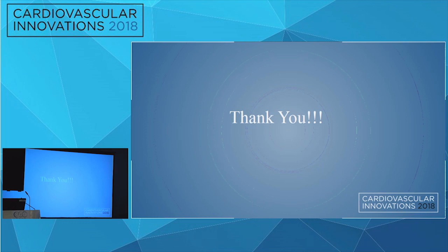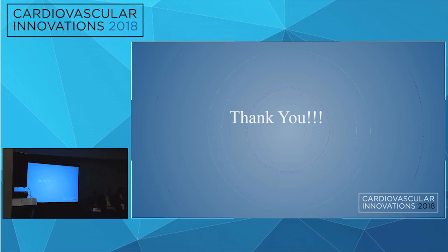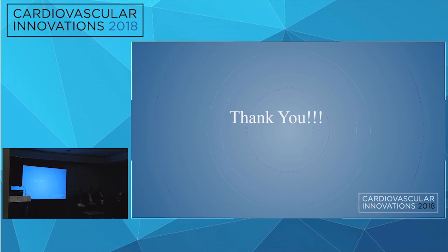That's a great case. I was just curious, did you do any provocative tests for PFO? Because you may not just be able to see it with color Doppler. You may have to give bubbles. I think they did a bubble study that was negative. There was no bubble. And no aneurysmal change to the septum, right? Yeah, no septal aneurysm.